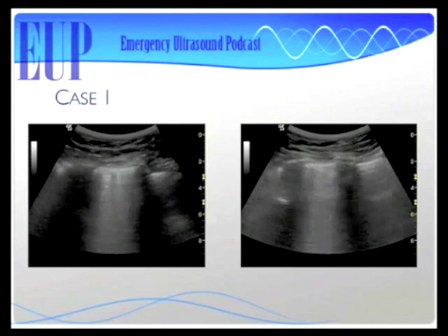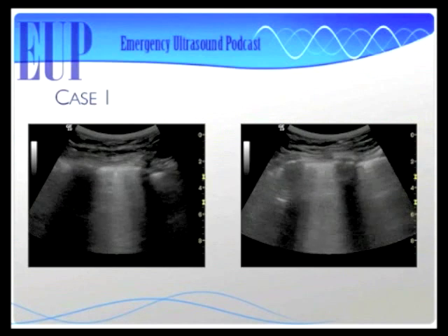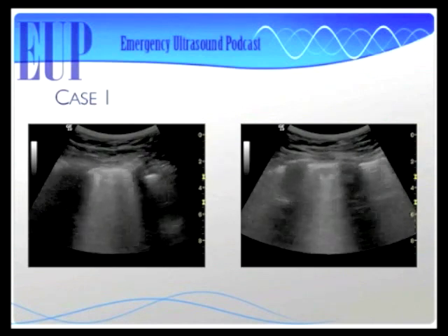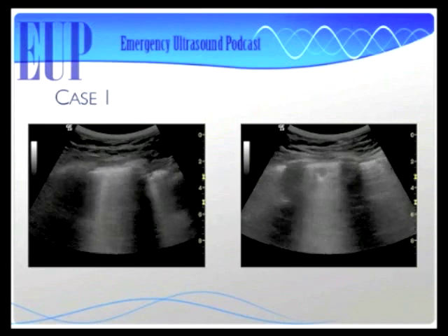So you still think it's COPD? Well, I'll give them the 2 liters and find out, I guess. So this is a case of cardiogenic pulmonary edema. Oh, dang. So close. So close.